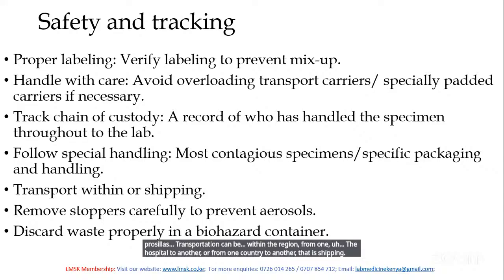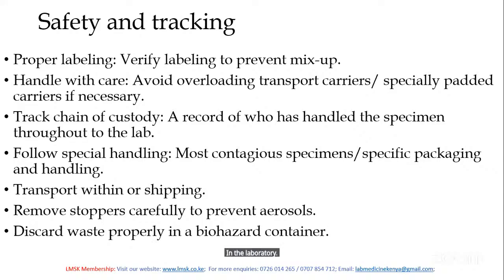In the laboratory, when you receive this packaging, make sure you remove the stoppers carefully to prevent aerosol, because they've been in transit, collision. This collision of the specimen as being transported can form aerosols. So they are dangerous. Discard waste properly in a biohazard container.